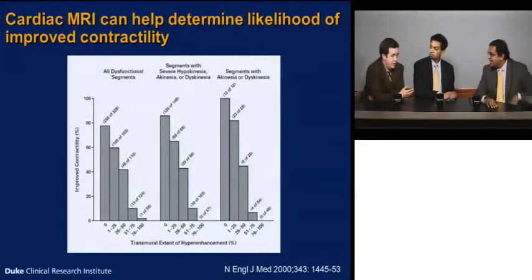I think what you were pointing out beforehand is looking at the wall motion abnormality here. You could really see that the anterior walls appear to be okay, and actually the inferior wall was really what's having problems here, so this really matches up with the delayed enhancement. So it is still a question of how much one can recruit from that inferior wall with revascularization.